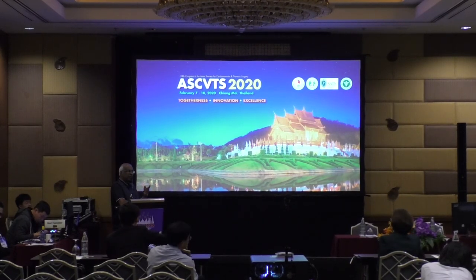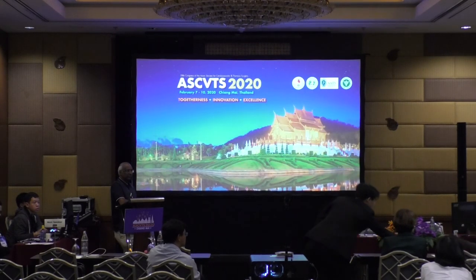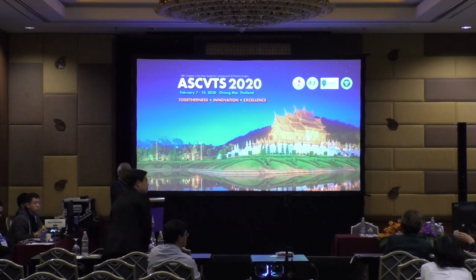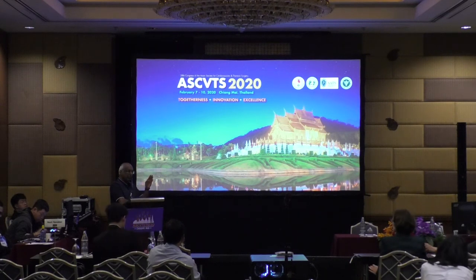Do you have any questions? Yeah. Some vendors have endo, mid, and the external. So lately I think they would like us to do the middle line for the ROI. That's the recommendation nowadays? But even that line in the middle, you move it a little bit, you get a different number.